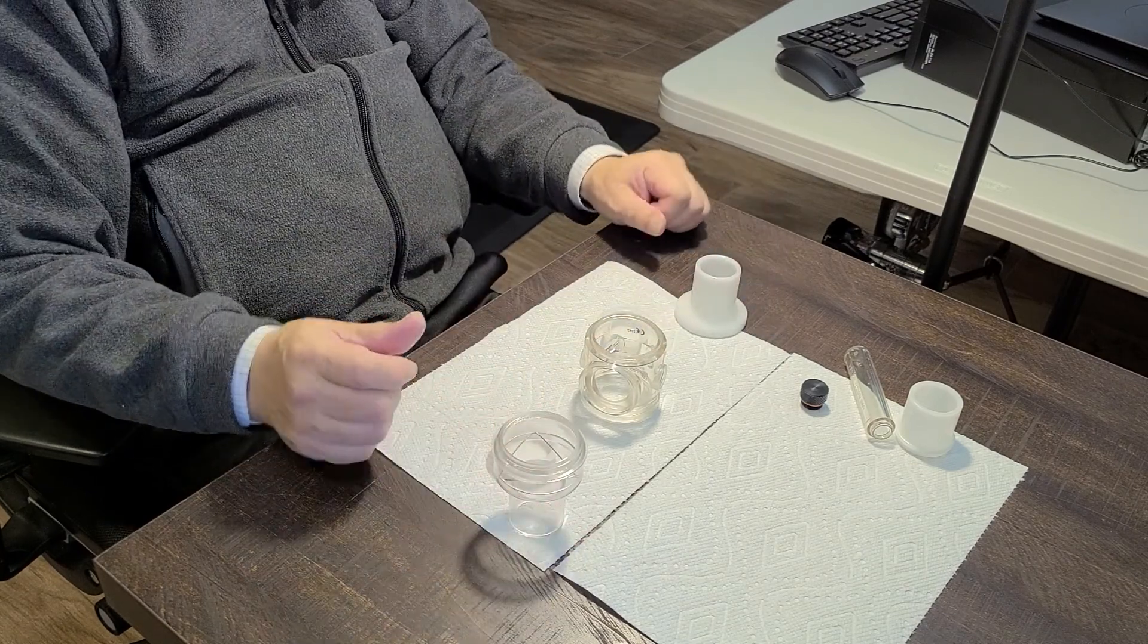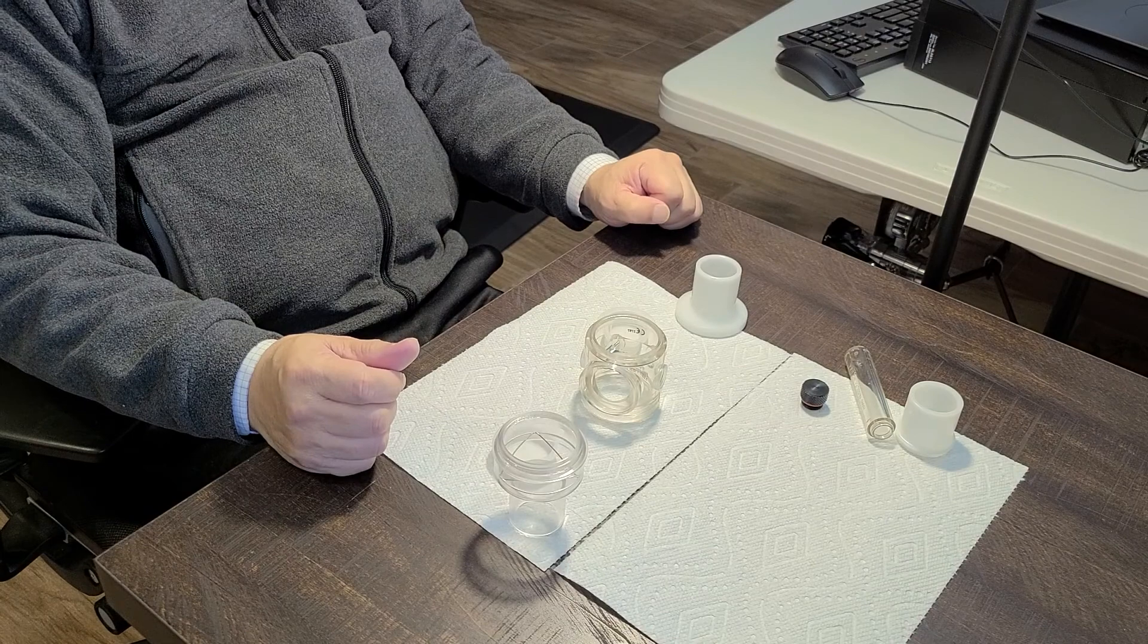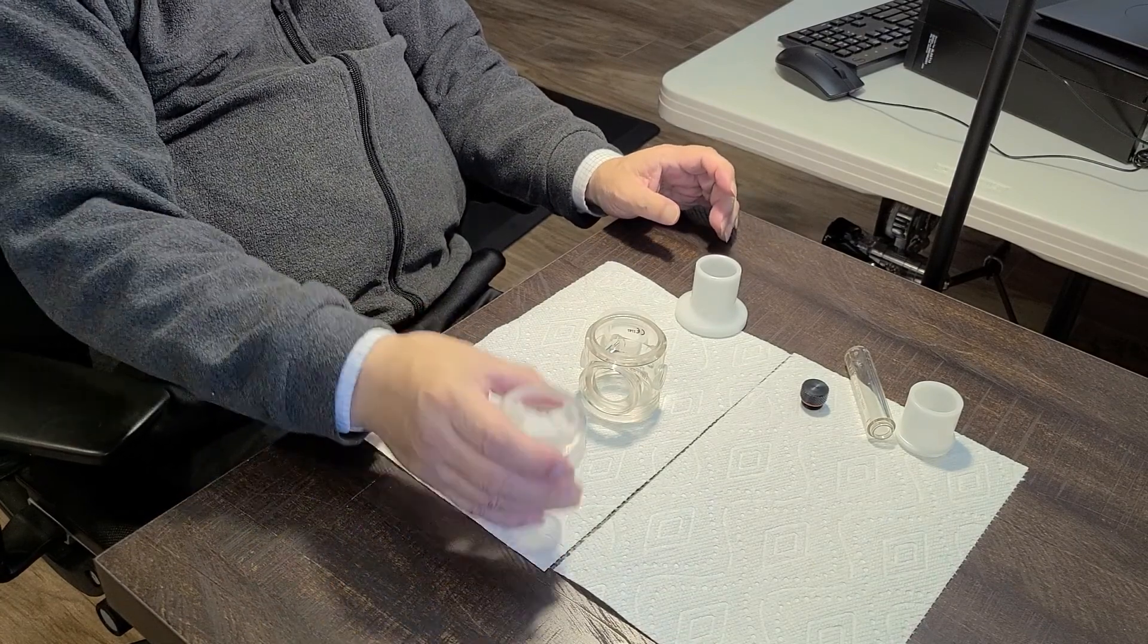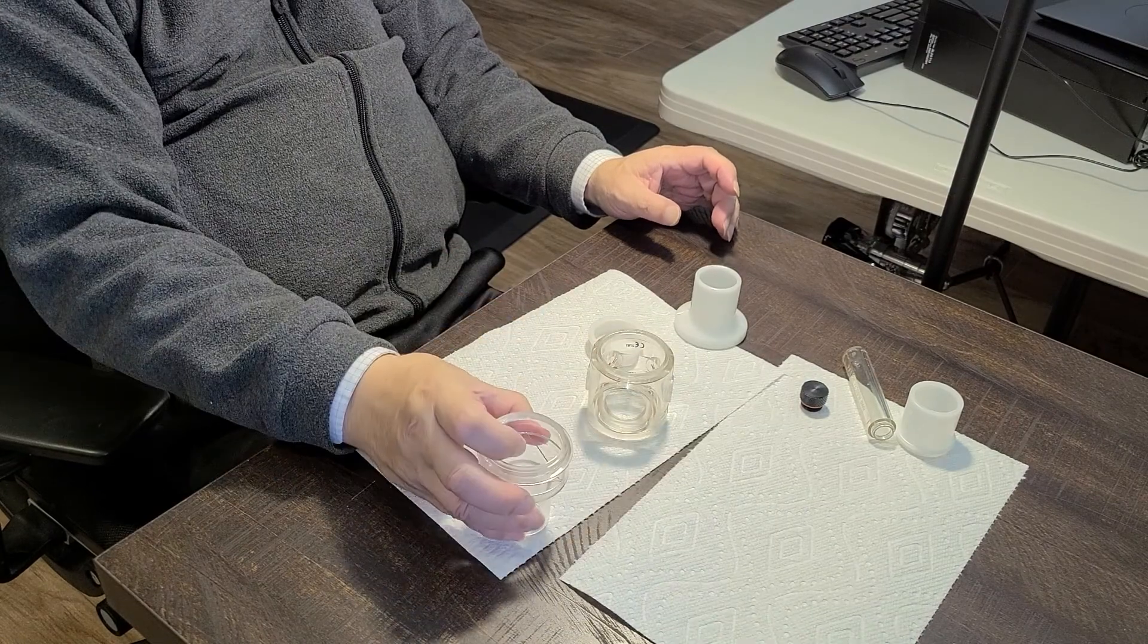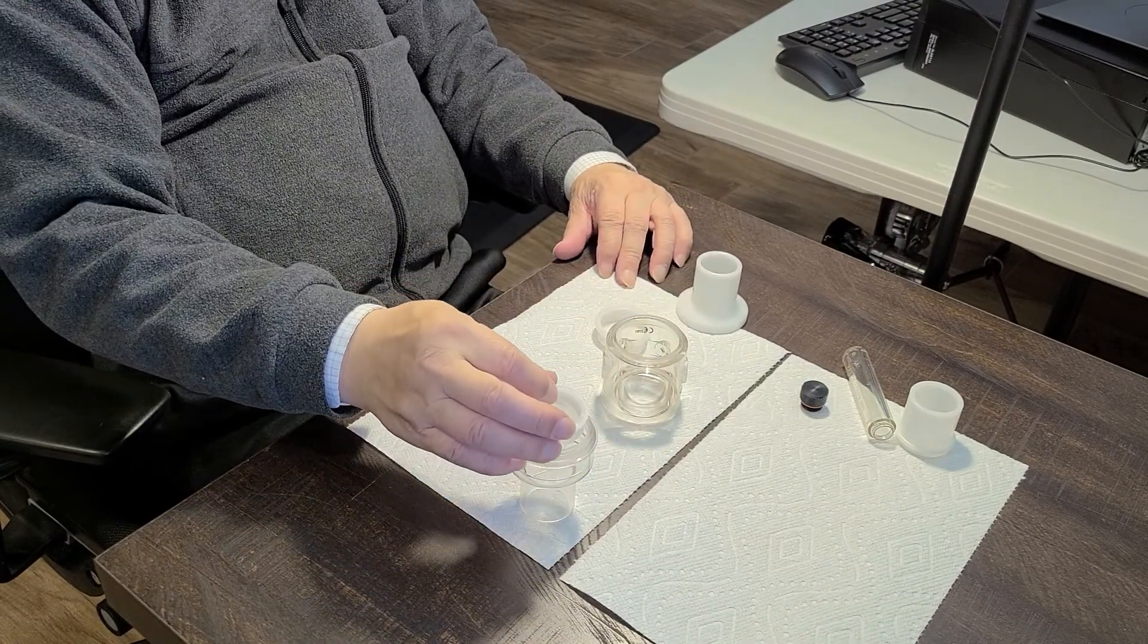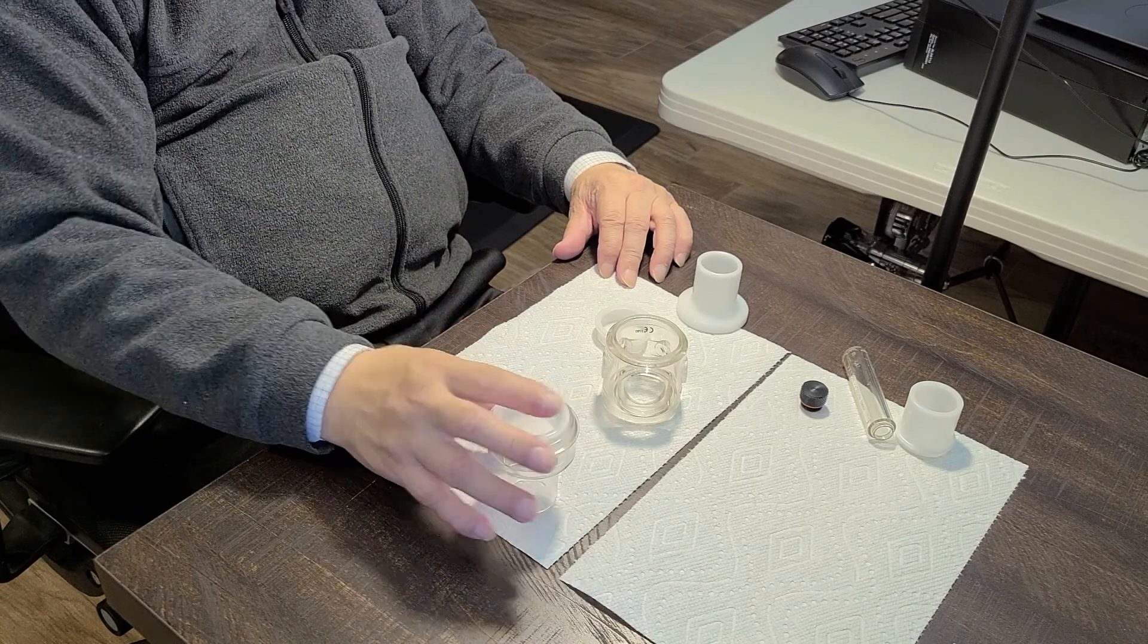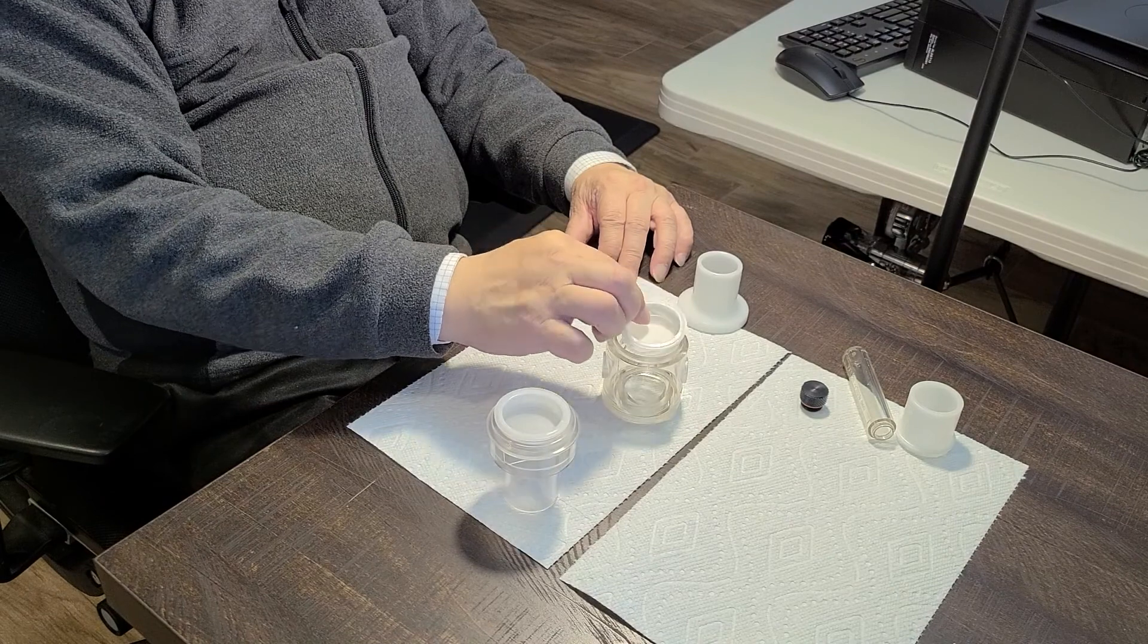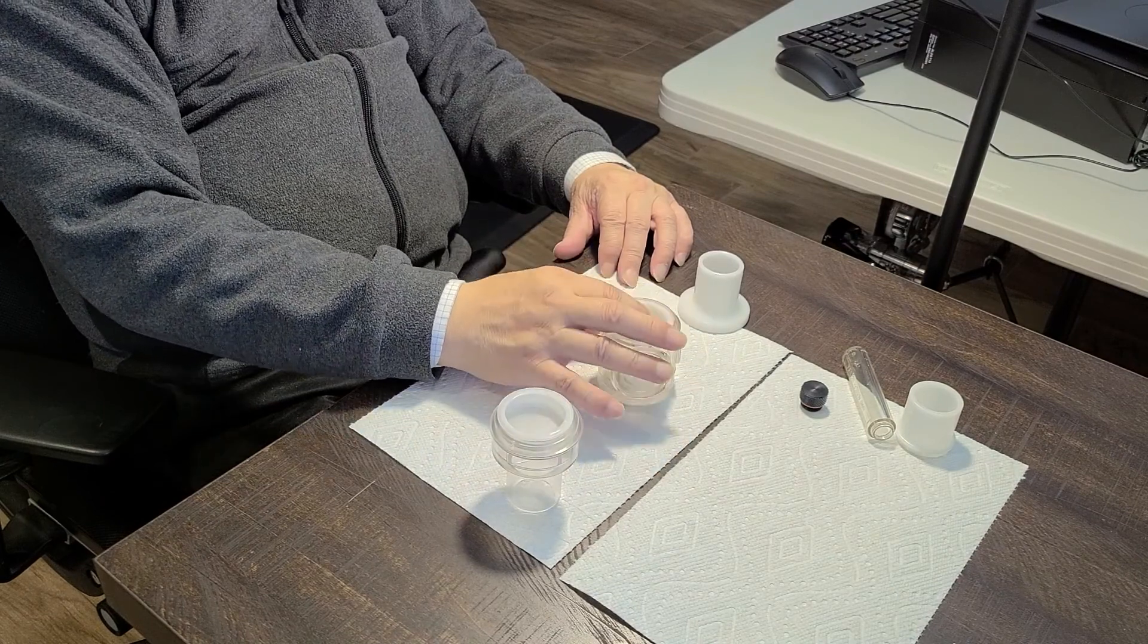After that, you have the bartender approach. This is the cup, this is the mug. You are the bartender. Then you pour the beer to the cup, then you pour the beer to the mug.